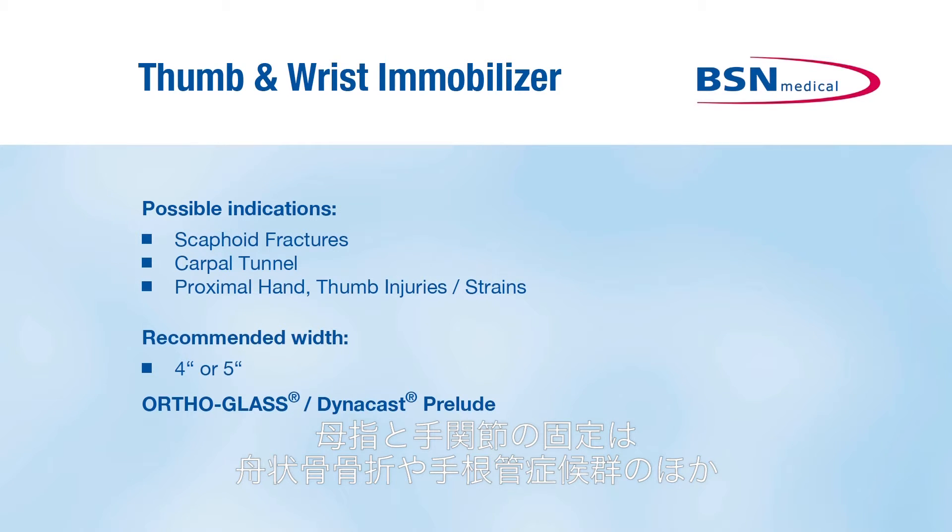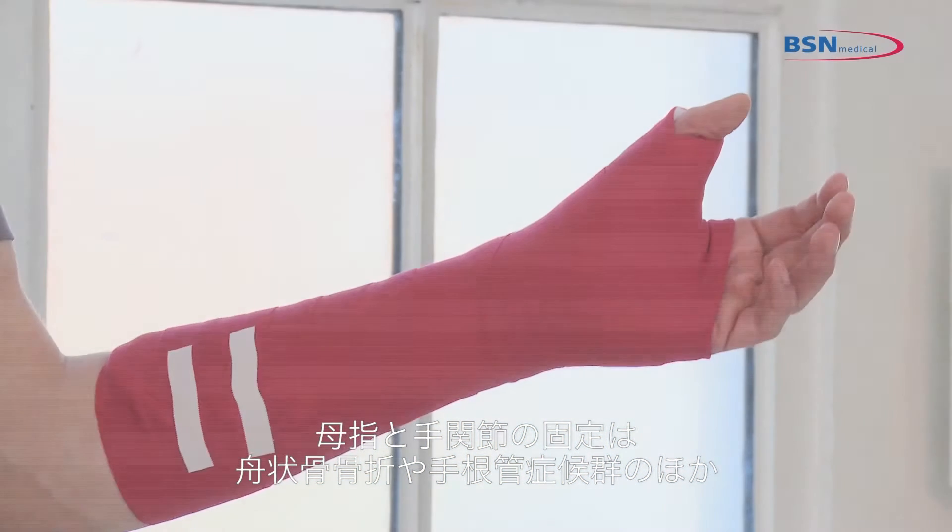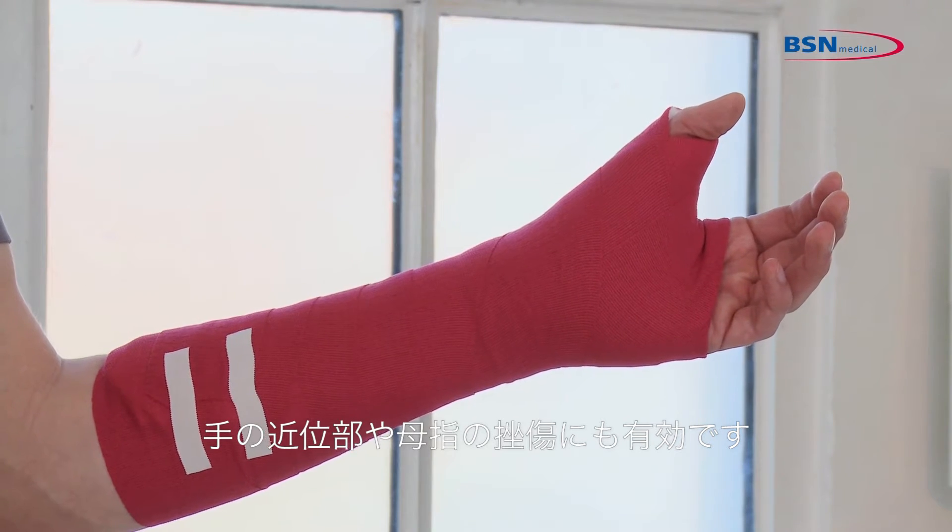The thumb and wrist immobilizer is a very good application for scaphoid fractures, carpal tunnel syndromes, as well as proximal hand and thumb injuries or strains.